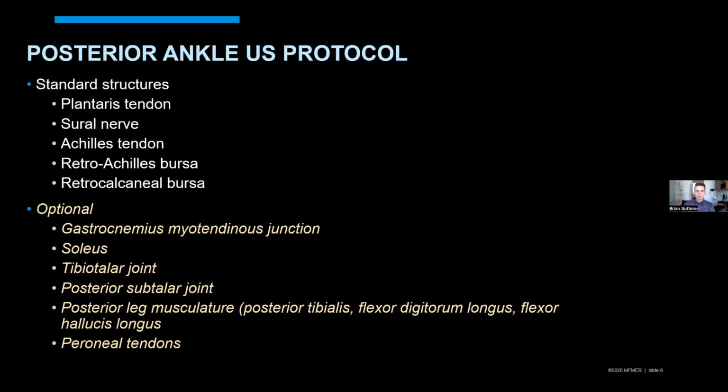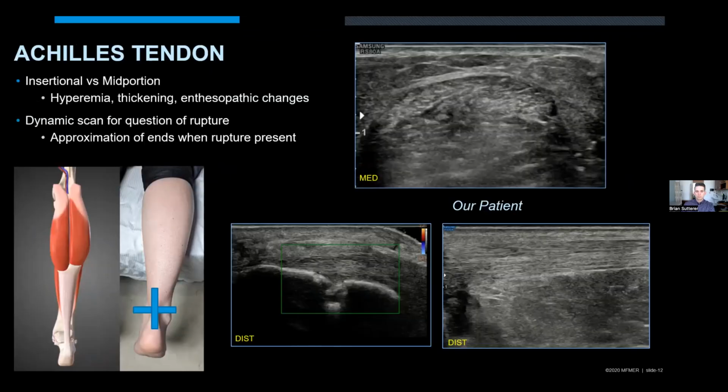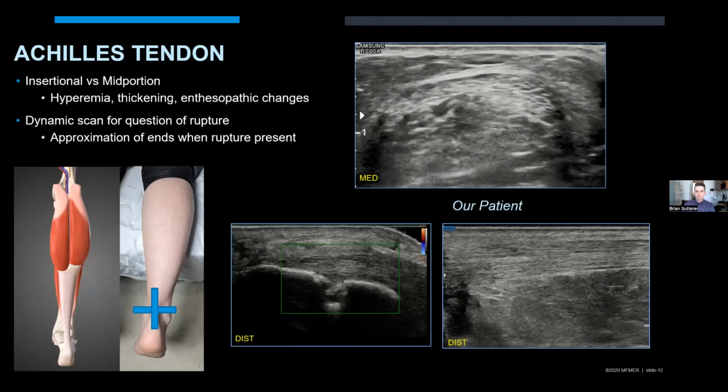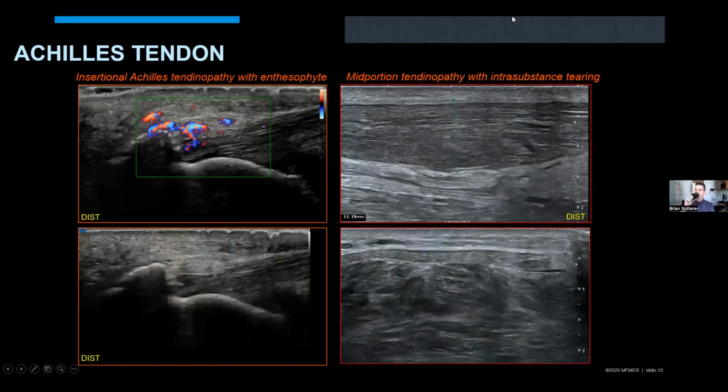Second point is, as you point out, distal Achilles tendon pain, or distal Achilles tendinosis or tendinopathy, however we want to term it, is heterogeneous. It's a group of abnormalities that we can see in variation with the retro-Achilles, the distal Achilles, the bone itself, whether Haglund's and enthesophytes or intratendinous calcifications, the retrocalcaneal bursa, the tendon itself, and variable amounts of tearing at the insertion. And so it's heterogeneous.